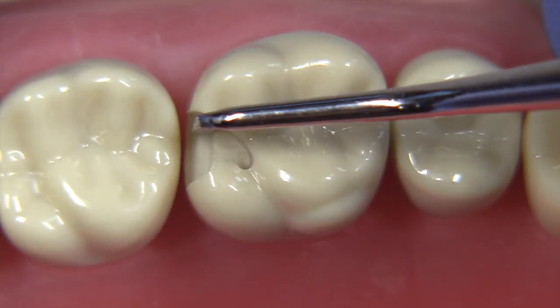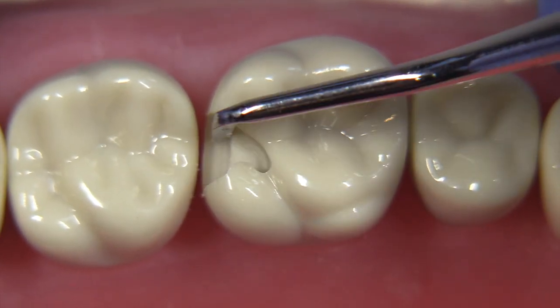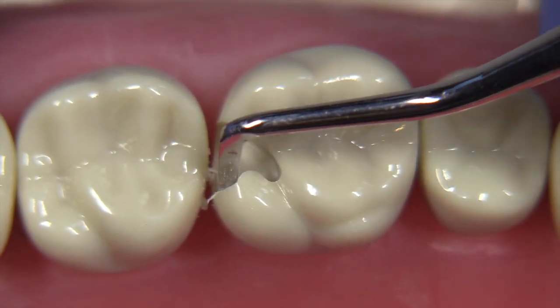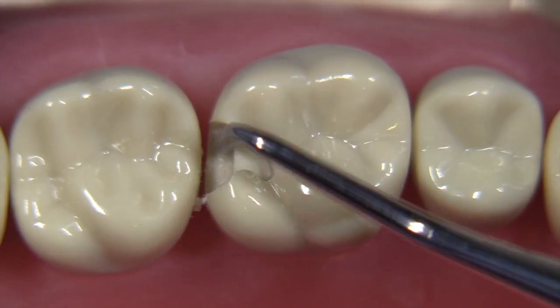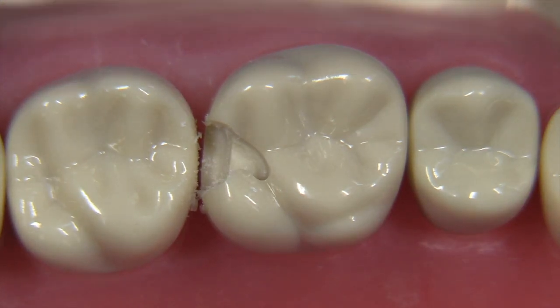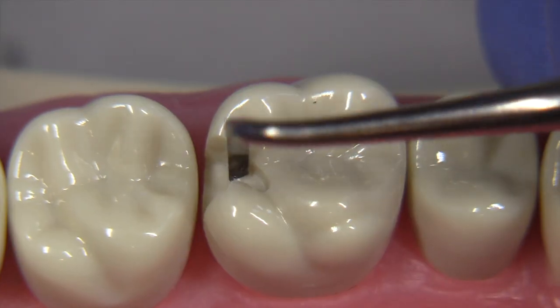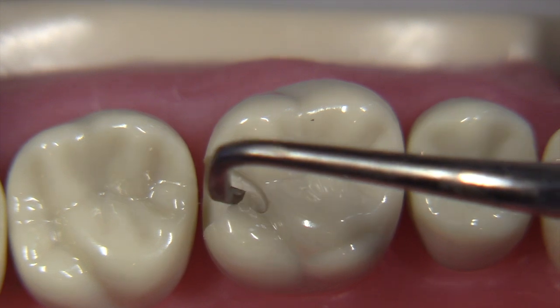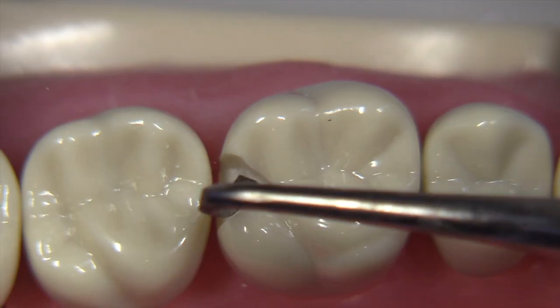That's basically the DO preparation. You can see that the little lingual bump there has been very helpful to give us a little bit of retention. This would be a preparation where I would place retention grooves because I'd want to have as much retention as possible. I don't think placing a dovetail off towards the facial would be a good idea because that would cut into the distal facial cusp. Now I'm using the gingival margin trimmer from the middle over to the buccal to create the axiopulpal bevel.